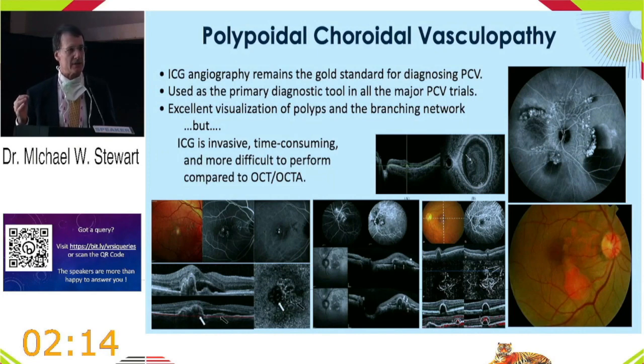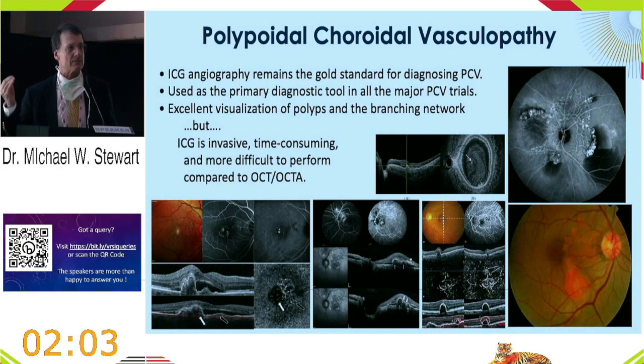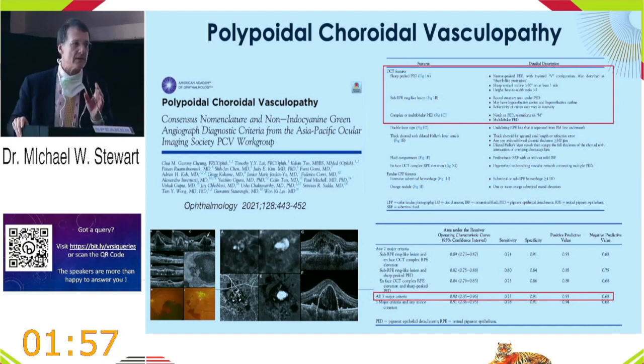However, ICG is time-consuming. It's difficult on the patient. It's more challenging for the technician. And so as a result, it's not always the diagnostic modality of choice. And the committee was convened to evaluate the ability of OCT in diagnosing polypoidal.